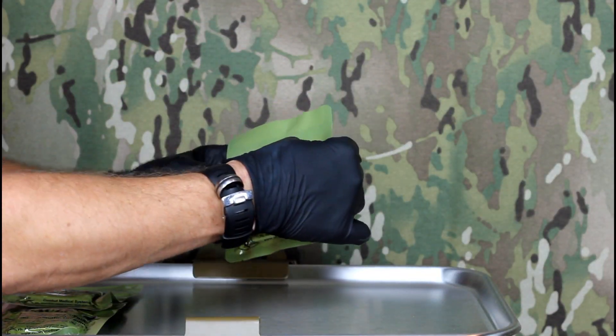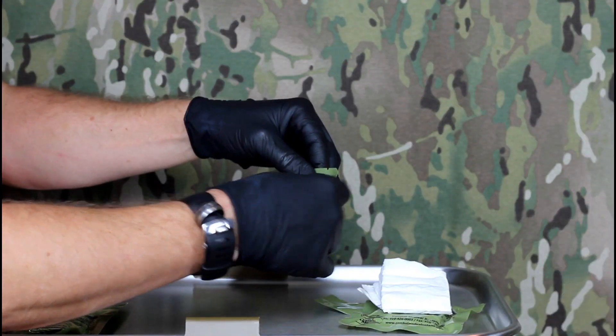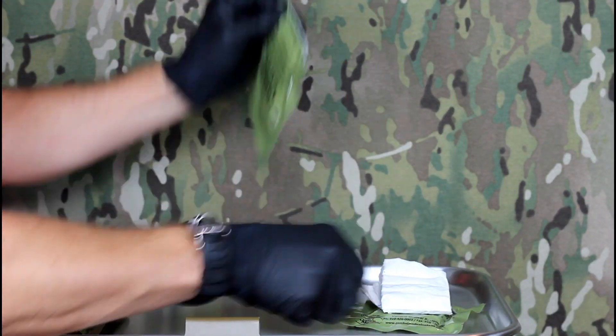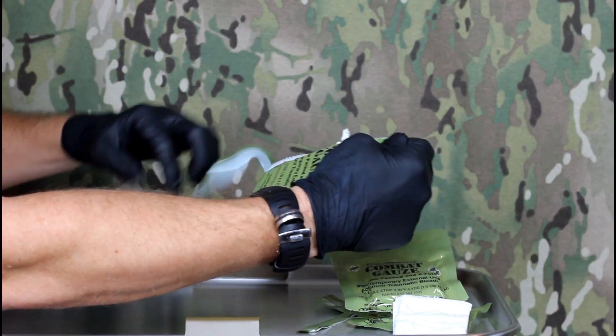Using the tear points, the package can be opened horizontally across the top or bottom of the package, as well as vertically along one side.